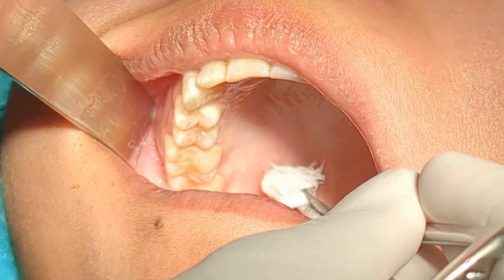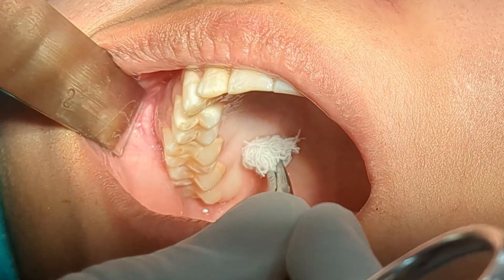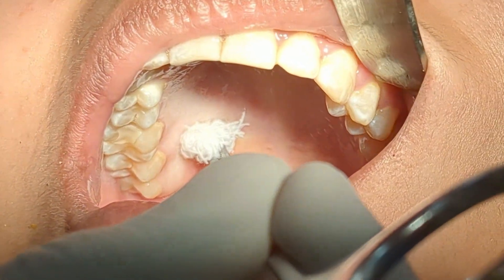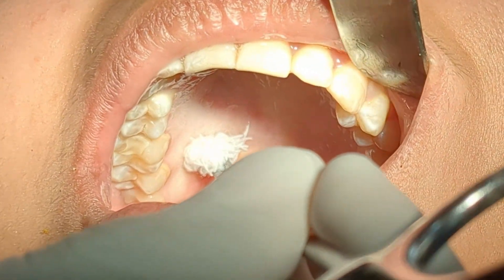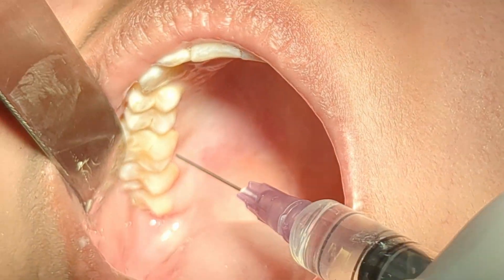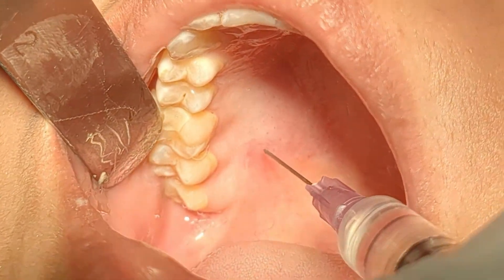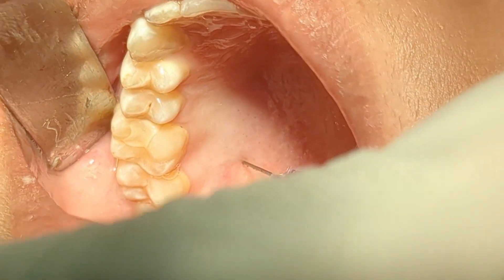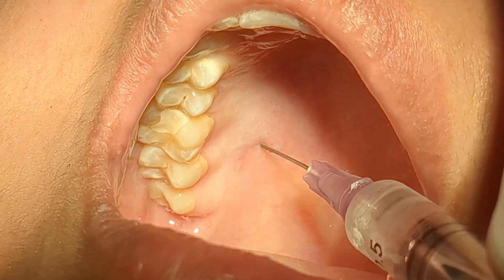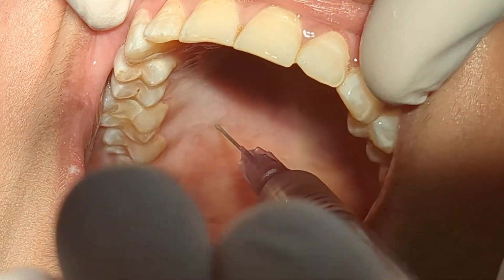Now I am applying topical anesthetic at the site of injection. For greater palatine nerve block you should approach the syringe from the contralateral side. Depth of insertion of needle is 4 to 5 mm. Now I am going to aspirate in two planes. Bi-planar aspiration is negative. I will start depositing the LA now. Amount of LA to be deposited is 0.5 ml.